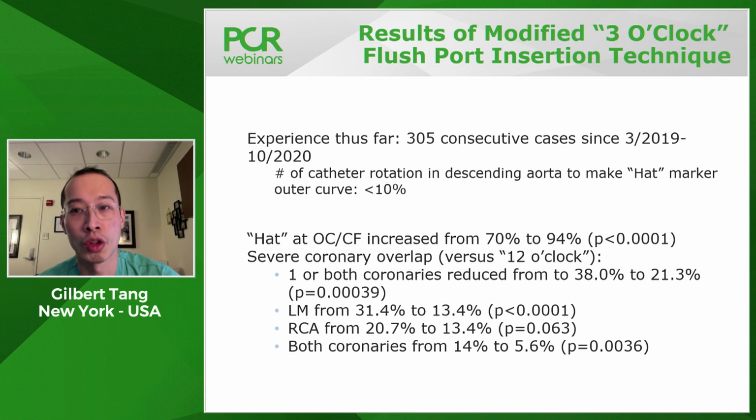We also dramatically reduced the incidence of severe coronary overlap from 38% down to 21% for one or both, left main from 31 to 13%, the right coronary from 20 to 13%, and only about 5% of the time would you have an overlap with both coronaries.